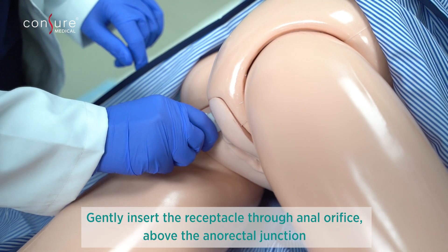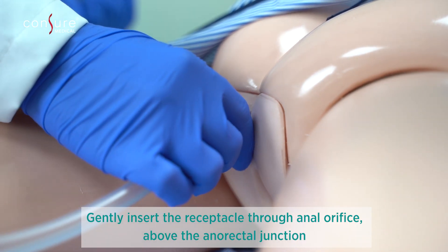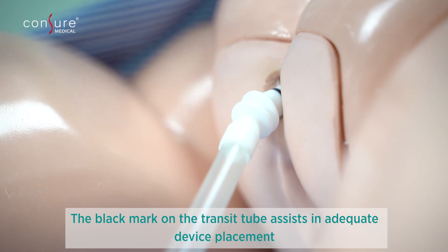Gently insert the receptacle through the anal orifice until it is past the anal canal and above the anal rectal junction. The black indicator on the receptacle in line with the anal orifice indicates correct placement.